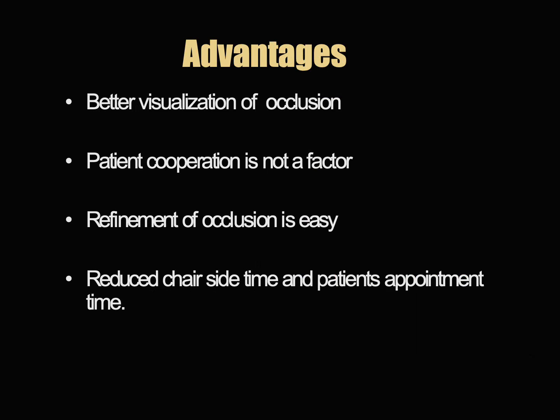The advantages of using an articulator. Better visualization of occlusion is possible with use of articulators. Patient cooperation is not a factor. Refinement of occlusion is easy. There is reduced chairside time and patient appointment time. It also becomes easier for us to visualize the occlusion from the lingual side.